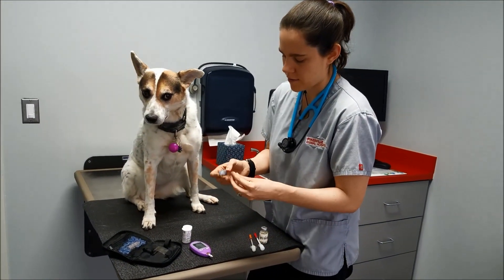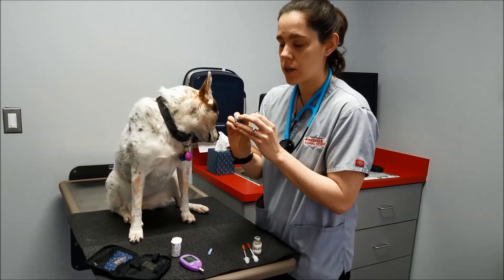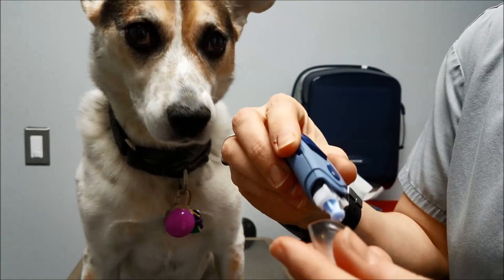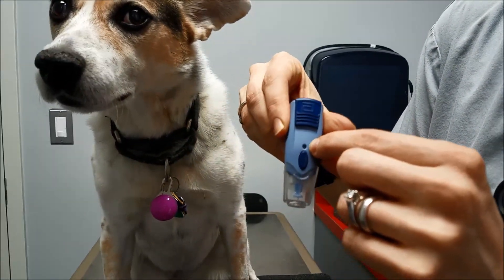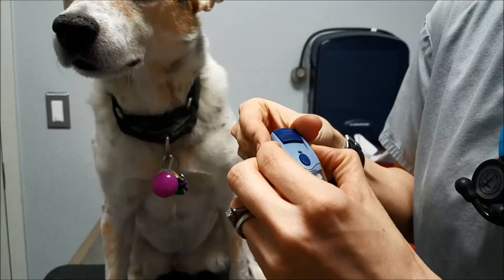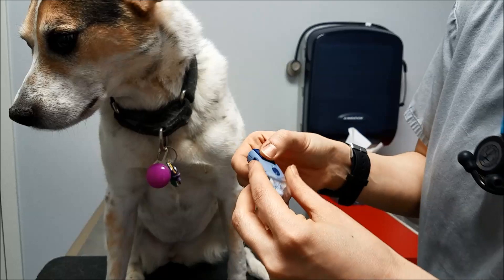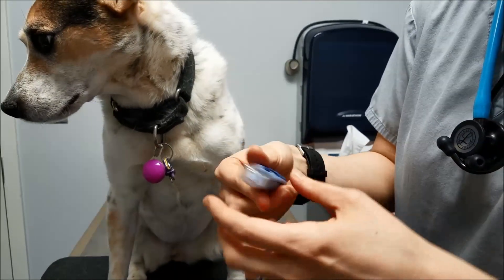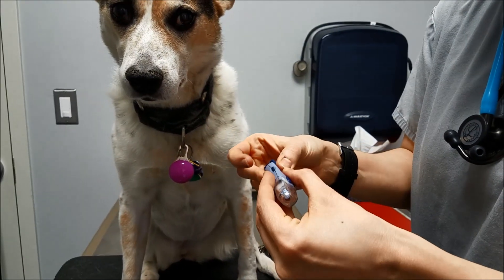So our Lancet — we have a little individual Lancet here. It has a little needle basically to poke in there. You want to make sure it's set at the right setting; there's a depth level here which you can move around. I'm gonna use two for her. To load the Lancet, you pull back and hear that snap. To release the Lancet, press that button. So I'm gonna load it.